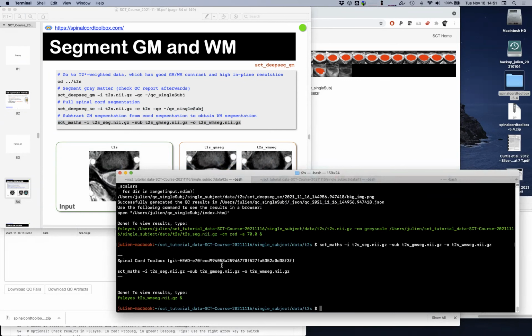So one thing I might miss in the explanations is related to the pre-processing you do to the images. Are these images at some point corrected for bias field, like low frequency intensity, which I presume is something you need to do in order to perform the segmentation?